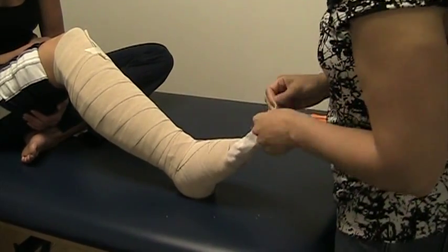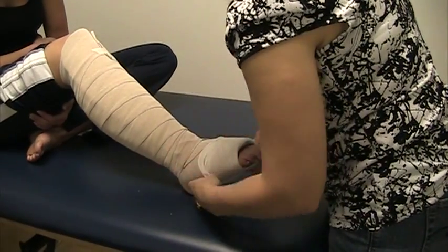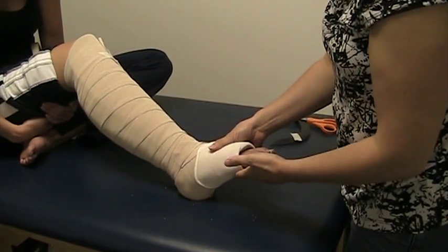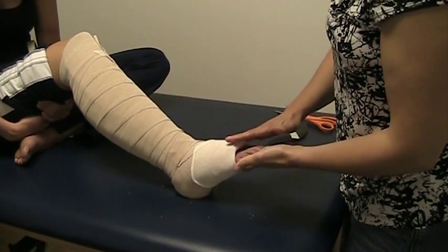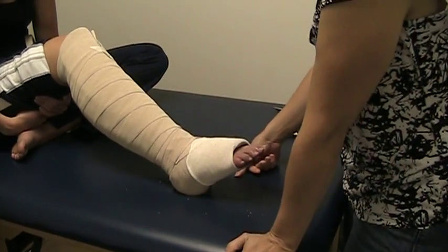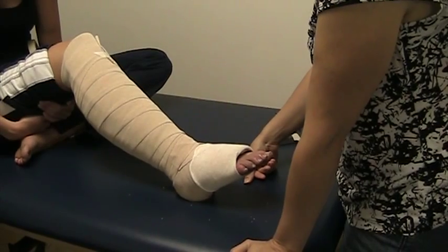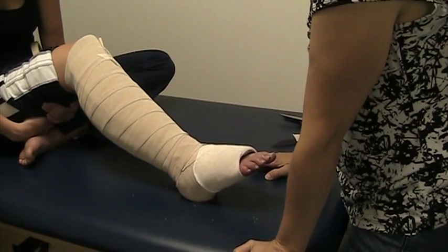That would complete the multi-layer short stretch bandaging of the right lower extremity on this patient. In our case study, we at times had both legs wrapped. You need to check with your patient to make sure that the coloring on their toes is good, that the sensation is normal, and that they're not experiencing any pain. Let your patient know that if they experience any pain or changes in sensation, they should remove the bandages immediately. That concludes this session of multi-layer short stretch bandaging.